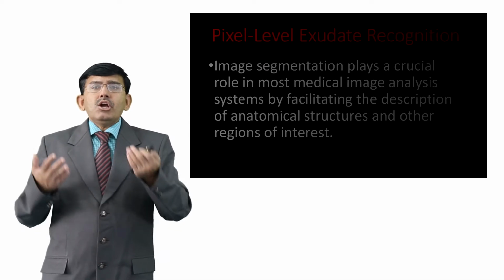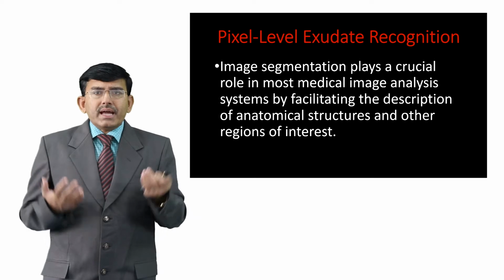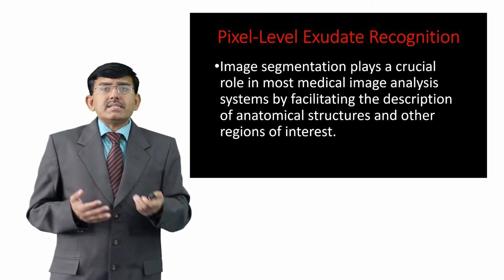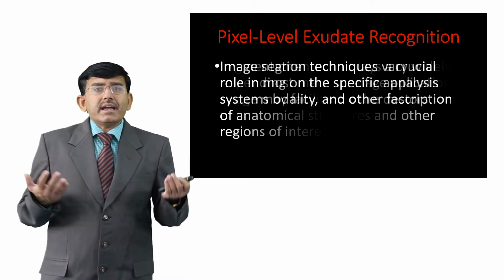Image segmentation will further help to get all the regions of interest which we want to use for the purpose of grading and so on.